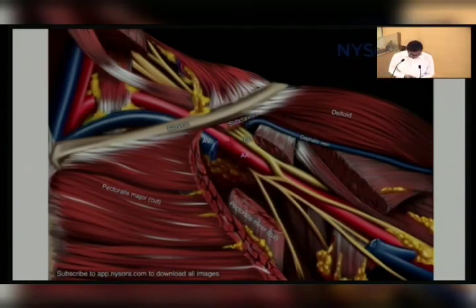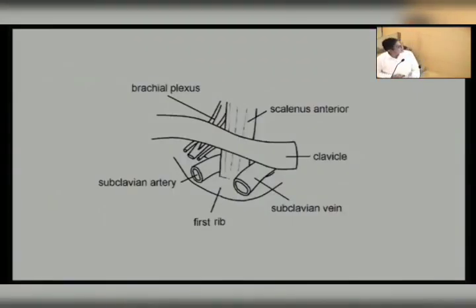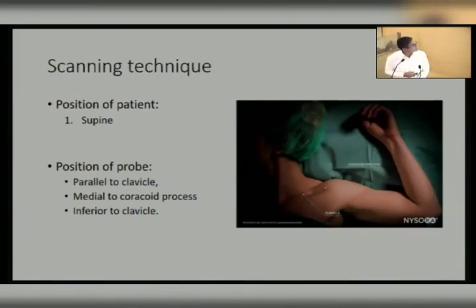So here we will find pec major, subclavius muscles, and here is the cord. The artery and vessels are over here, the clavicle over here, and this is one of the best diagrams to know the costoclavicular space. This space is compact and fixed, with less variation, so it is a very good space for brachial plexus block and can be utilized for continuous block. See, this is again the costoclavicular space.